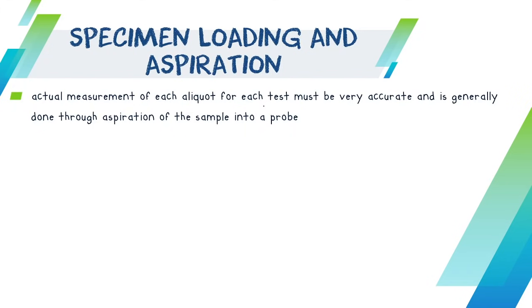Kaya if it will not reach that level, then you need to transfer it to a smaller container. Mga ingana. So naa tay mga machine na ingana, na naa na silay limit, although kung dili man pre-measured, naa na silay ways na ma-identify na up to diri na level ang inyong volume sa inyong serum na naa sa tube.